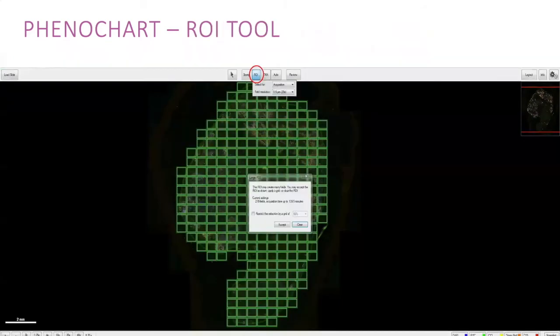When selecting your regions of interest, you can use the ROI tool which allows you to draw a region of interest for imaging. It creates stamp annotations corresponding to the regions you draw. This may be useful when you want to acquire multi-spectral imagery for a specific region on your slide. The edges of the tissue should be excluded from the annotation as they are likely to cause artifacts.